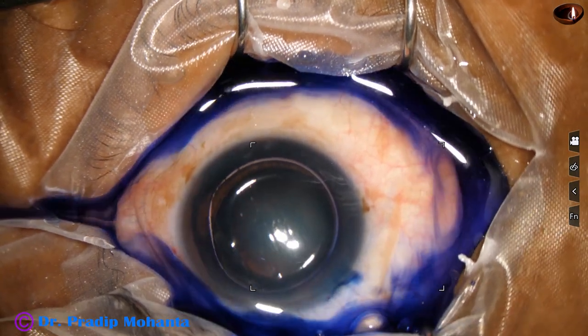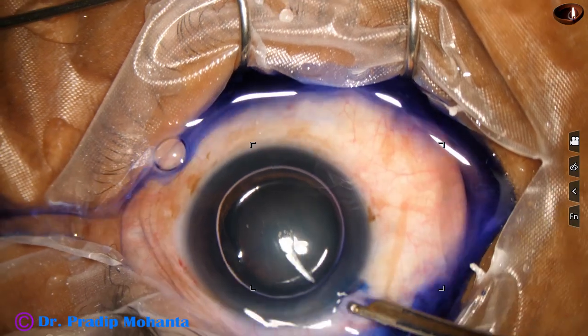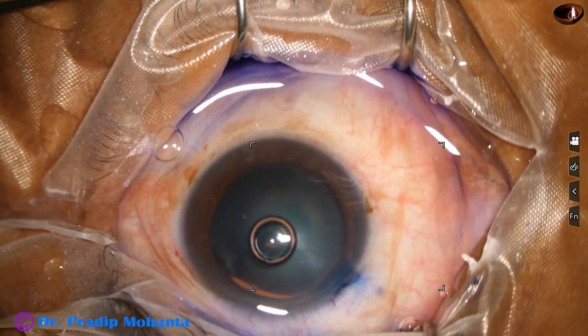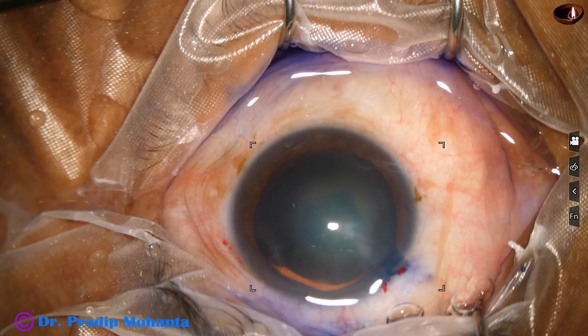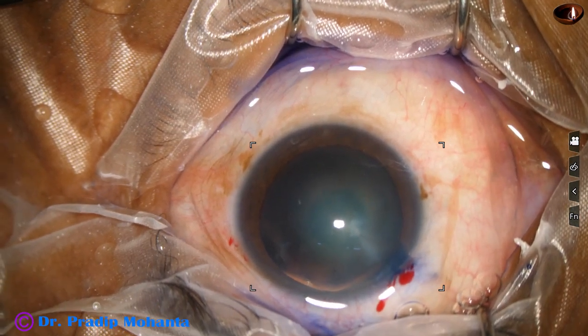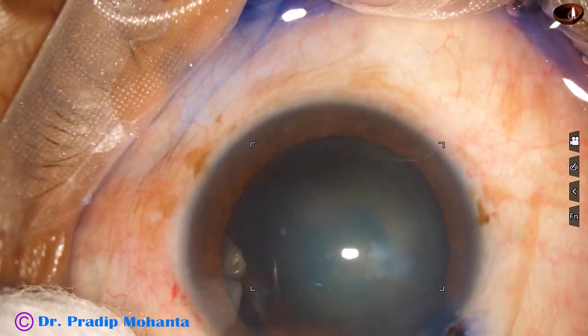By this time the incisions have been made. Two incisions have been made and the anterior capsule has been stained with trypan blue dye. Viscoelastic substance is injected into the anterior chamber.